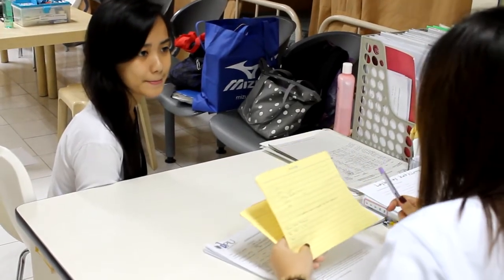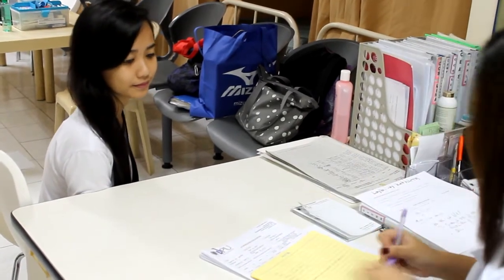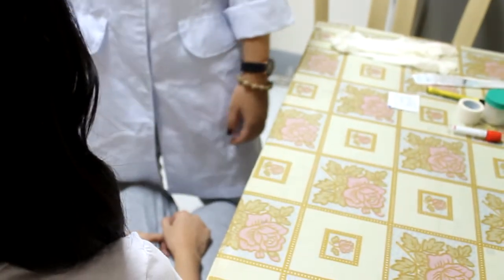Allergic to latex or adhesives? Hindi po. Assemble the necessary equipment needed for the procedure. Wash hands and put on gloves.